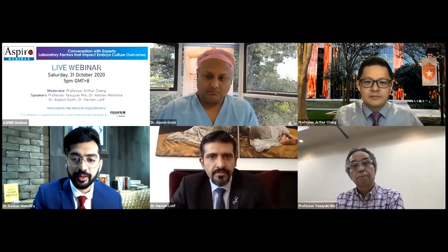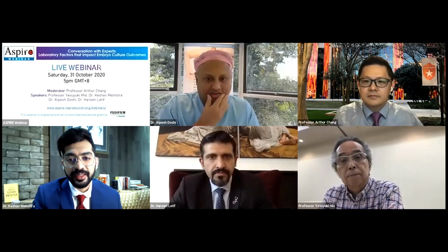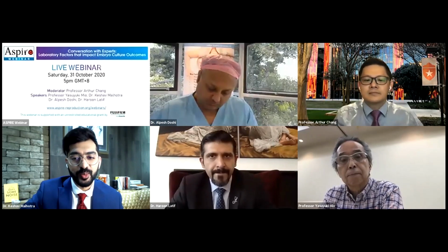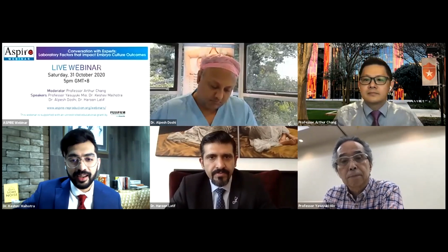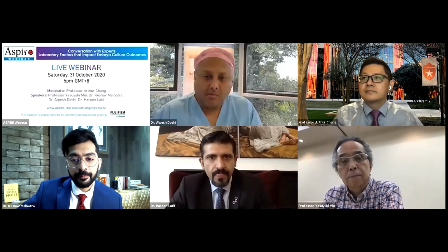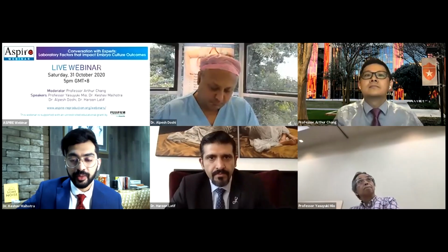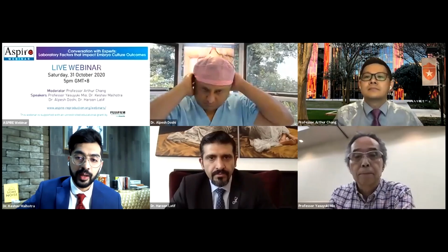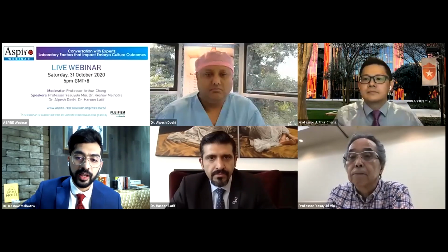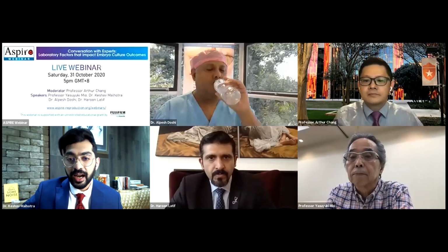So thank you, Ashok, for that very interesting question, because this is one place where there's a lot of variance which would exist between embryologists. If I go to the physical characteristics at this point, it's worth noting that both equilibration solution and vitrification solutions are toxic to embryos. And when we do vitrification at 37 degrees, the toxic effects are potentially higher.